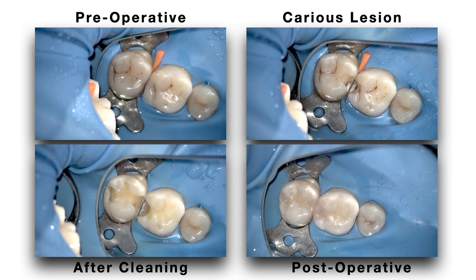But before I touch the case, I tell the patient that when we open a class 2, because food impaction is suspected, mostly the neighboring tooth also gets caries. So I tell the patient that if we open this cavity and see caries in the other tooth, do you give me a green light to complete the case, or what's your decision?